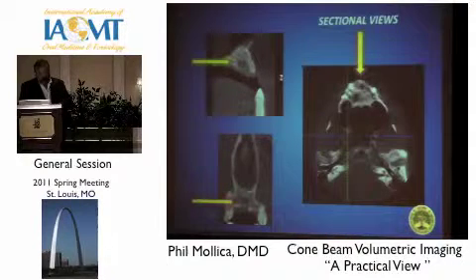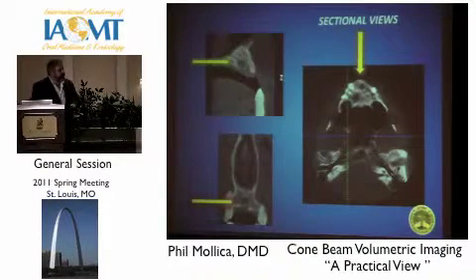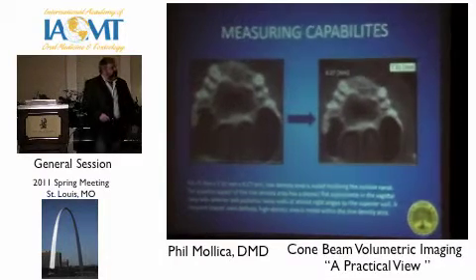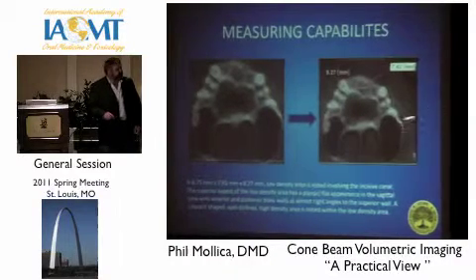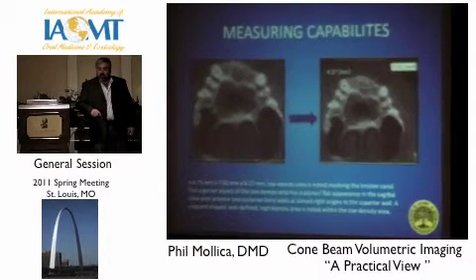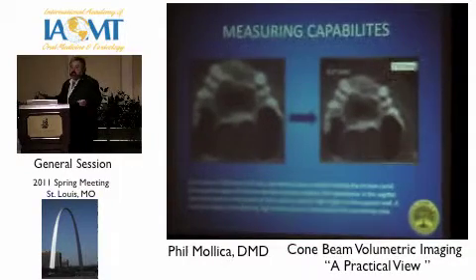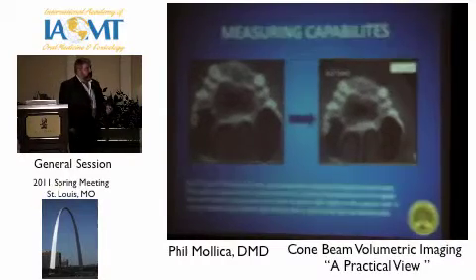After I saw this, I went up there and did a little nerve block right up here. Guess what happened? Pain went away. So the information I got back from the radiology group, you can actually, with this system, measure things exactly. It's a low density area, and they give the complete description of the lesion itself. So this guy's been running around for a couple of years thinking it's brain nerve damage. We found the lesion that was traumatically induced.